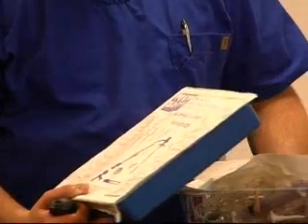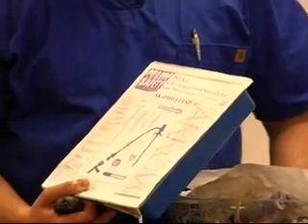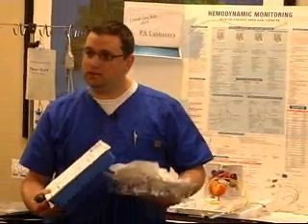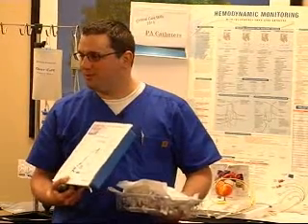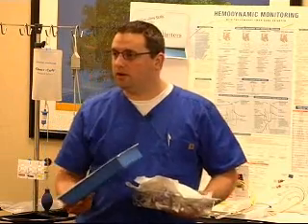Also, we do use the obturator cap, or the little blue cap that covers the tip, if we're not actually going to put a device in the introducer, or if we take it out and we want to maintain sterility of the tip so we could reinsert a catheter into it. If you happen to not keep the one from the package, we actually do have a stash of those in Running Green in our equipment room.